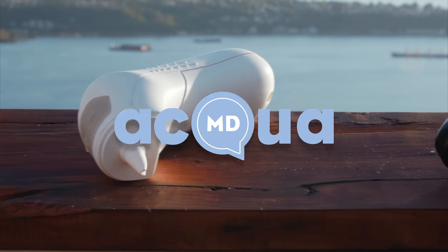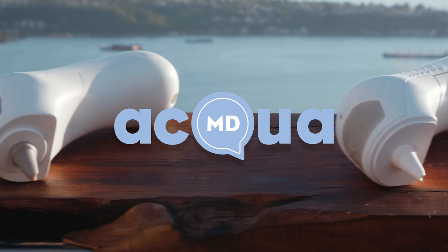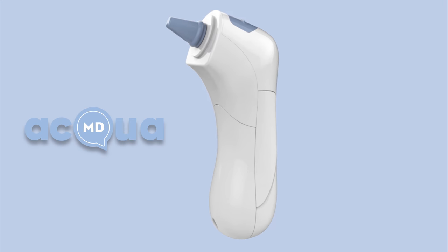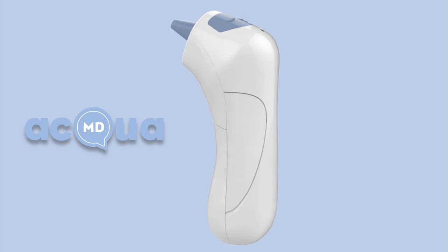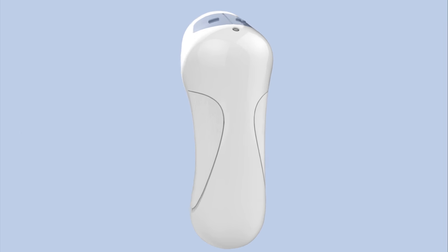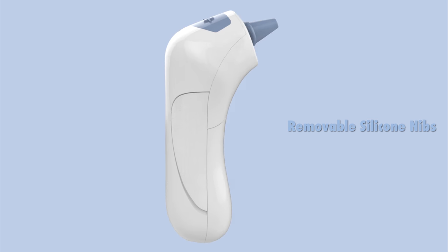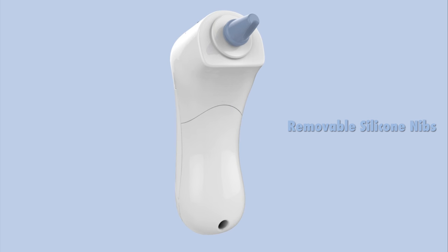Introducing AquaMD. After multiple rounds of prototypes, research and development, we are pleased to present you with a state-of-the-art, one-of-a-kind wireless device with a smooth, ergonomic shape that allows for a sleek design with textured grip for comfortable use. AquaMD is battery operated and takes two interchangeable AA batteries. AquaMD also comes with easy-to-change silicone nibs no larger than a common household ear thermometer for a comfortable fit for children, adults, and ears of all sizes — a medium nib and small nib.